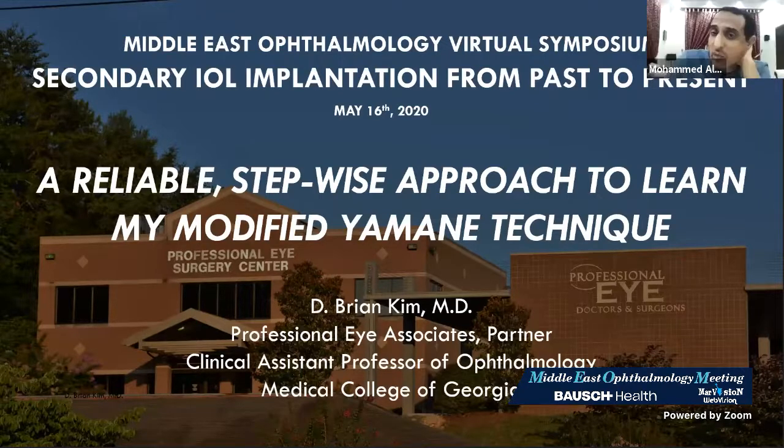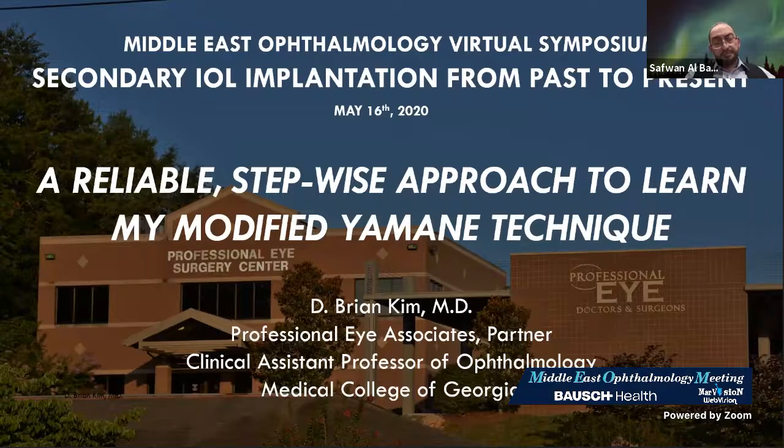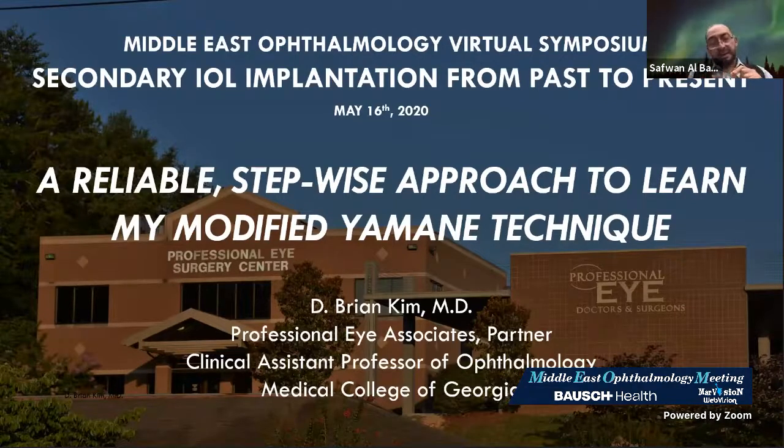Okay. Dr. Kim, how do you decide how much to cauterize? Just a small amount to create a small bulb. You just want to prevent the haptic from going through the sclera. It's about 1 to 1.5 millimeters. If you need to measure it to create a hinge, it's around 1 to 1.5 millimeters. I measure it and put a mark for it, so the hinge is between 1 to 1.5 millimeters and will be resistant to the sclerotomy tunnel.